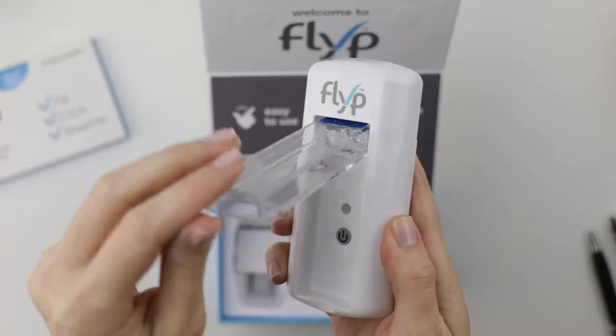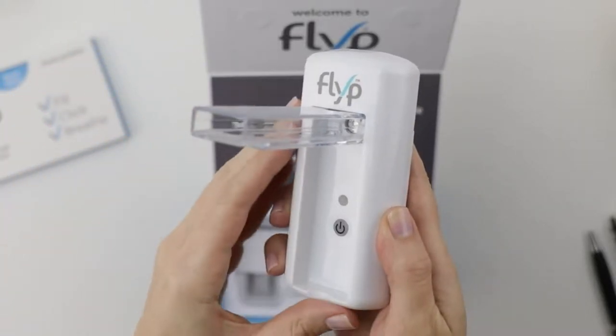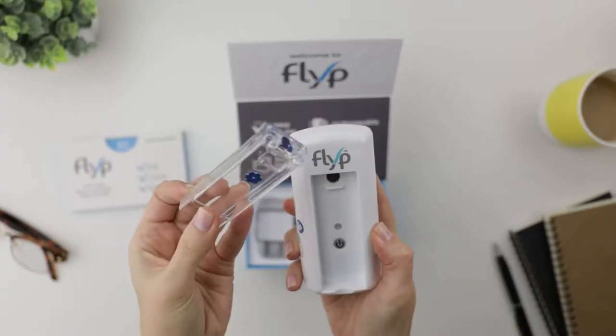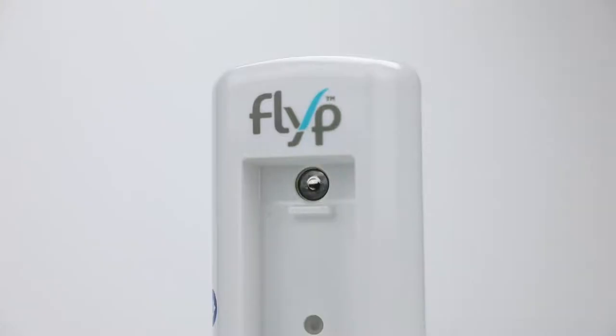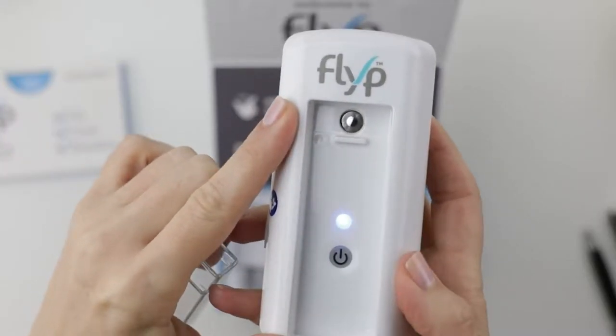Now look at this mouthpiece — really smooth open and closed flipping action. I'm going out on a limb here, but I think that's where they got the name. That has got to make cleaning easy. And right here, see this tiny disc in here? They say it helps make treatments super quiet.